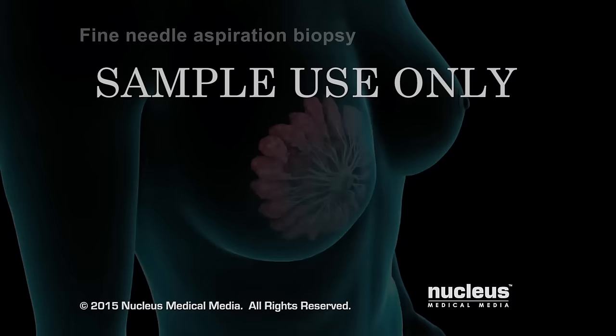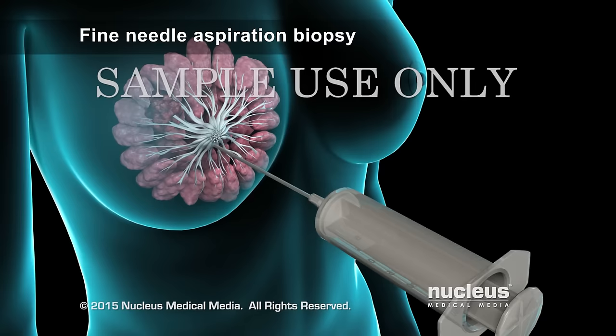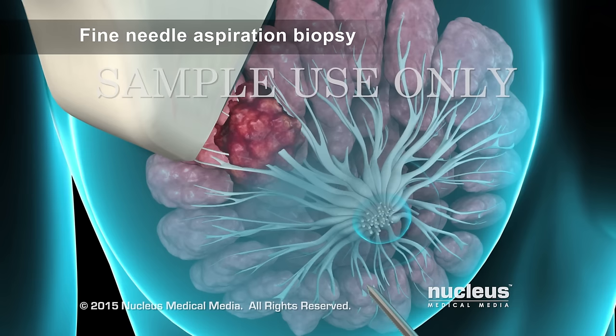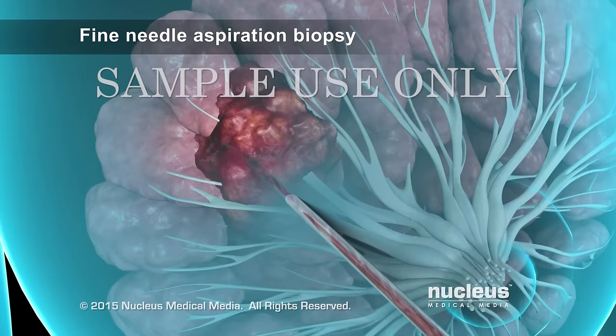During a fine needle aspiration biopsy, your doctor will insert a needle into your breast. Some form of guidance, such as an ultrasound probe, will be used to guide the needle to the correct area. Then, fluid or a small sample of tissue will be removed.